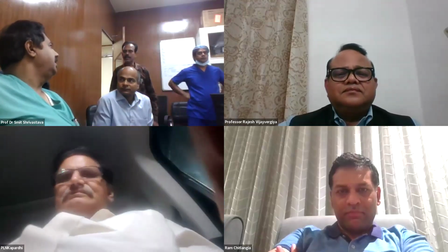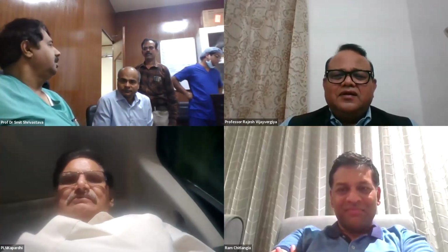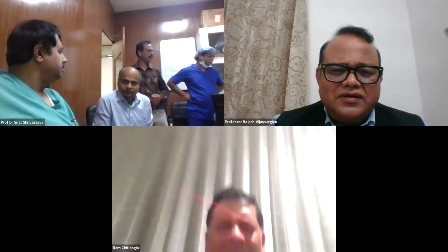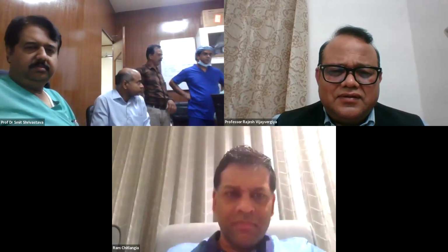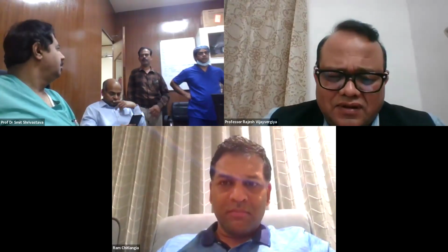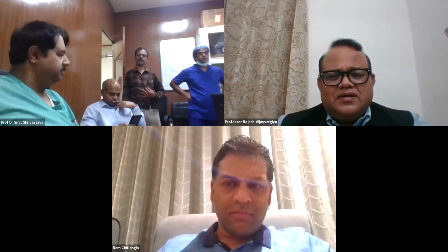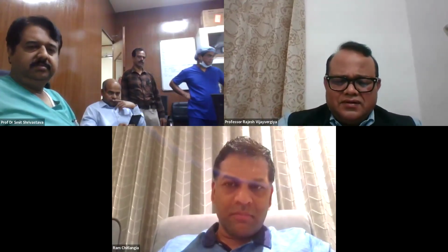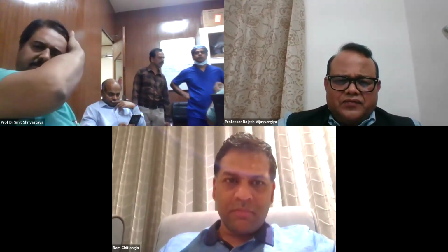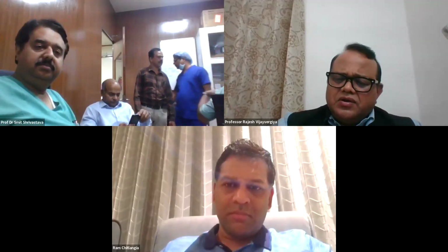Good evening, sir. Swajate here. Sometimes in the LAD, after stenting, we find the stent is fine, but the LAD ostium looks like a D rather than an O. Although area-wise it might be creeping up over 8, it looks D-shaped or oval-shaped and doesn't look perfectly O-shaped. Is it significant in the long run, or do we need to go aggressive again and try to achieve sphericity, the so-called sphericity index?